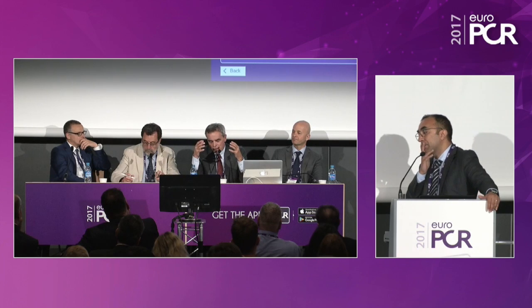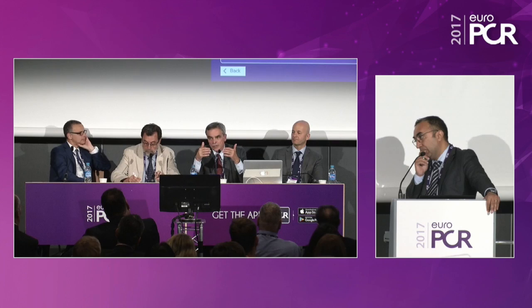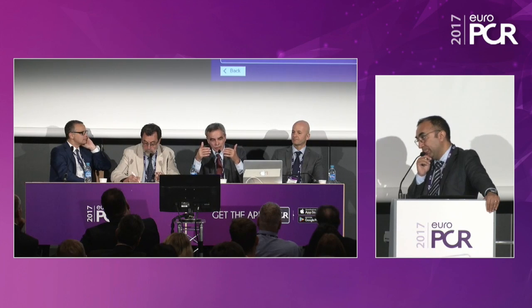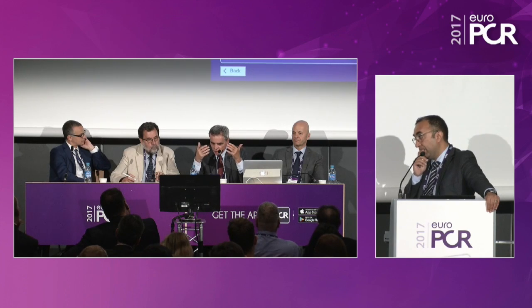So I think at this point in time, for me, the inclusion of a patient into the Cardioband program is when it's technically feasible. So if I can do it, I do it. And as Francesco stressed, it doesn't prevent you from any further intervention.